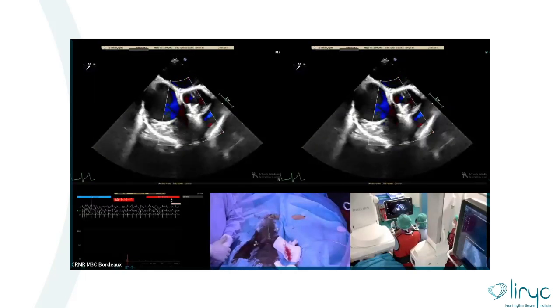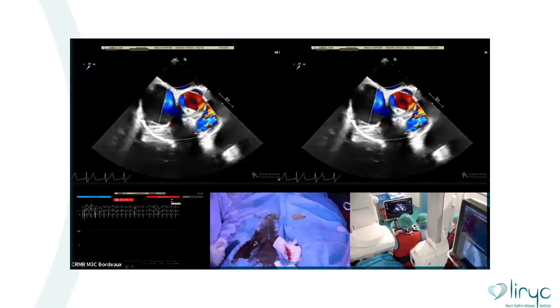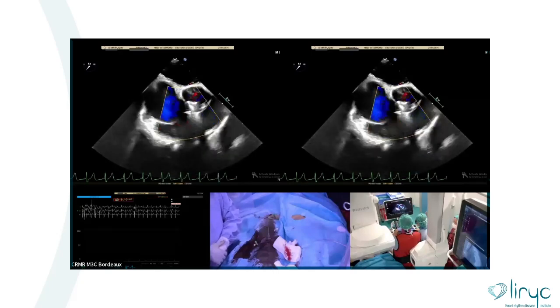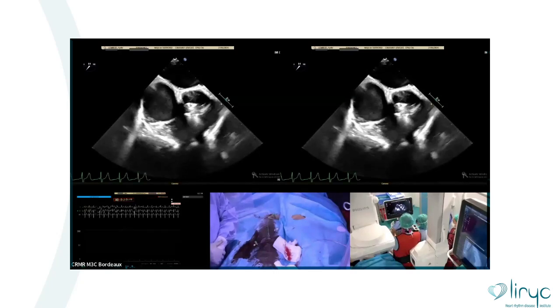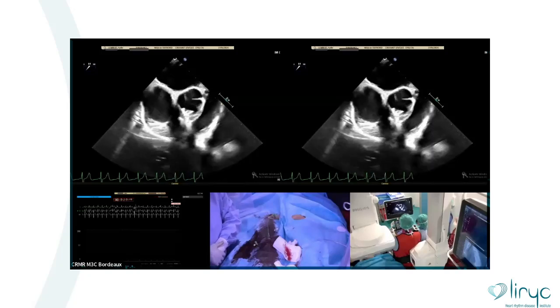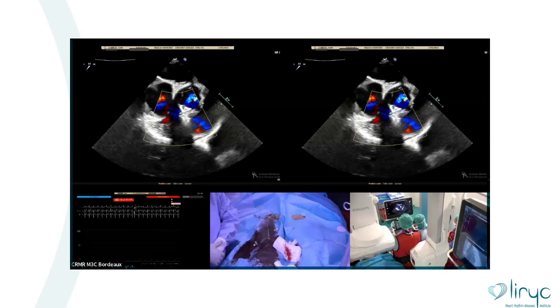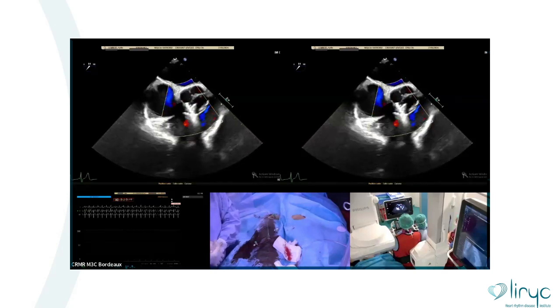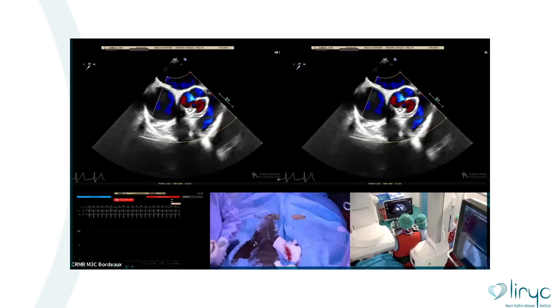Here in this short axis view, you could see that the regurgitation is mainly central. So it's probably more linked to the cable inside the valve than the device itself. To me, the device looks good. There is good motion of the leaflets of the aortic valve. I don't see any prolapse or abnormal motion. So the left disc is in a good position, and the regurgitation is more due to the cable than the device.